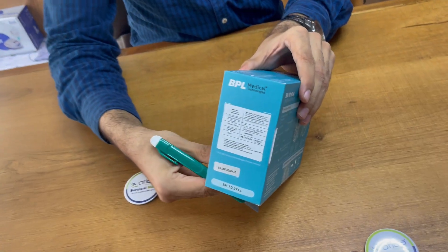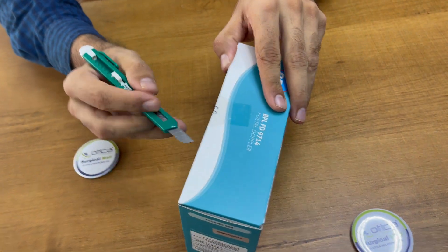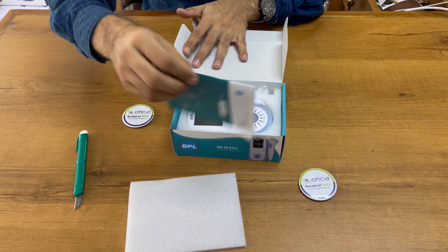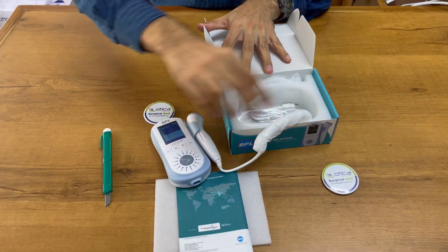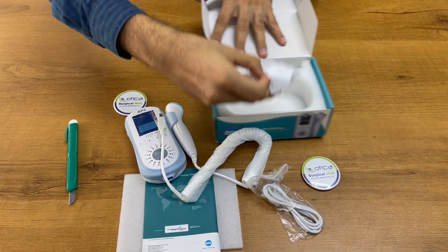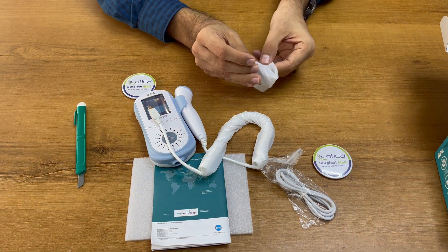Now we are going to unlock this. You can see one user manual they have given. This is the main unit. This is the charging cable and this is the charger adapter.